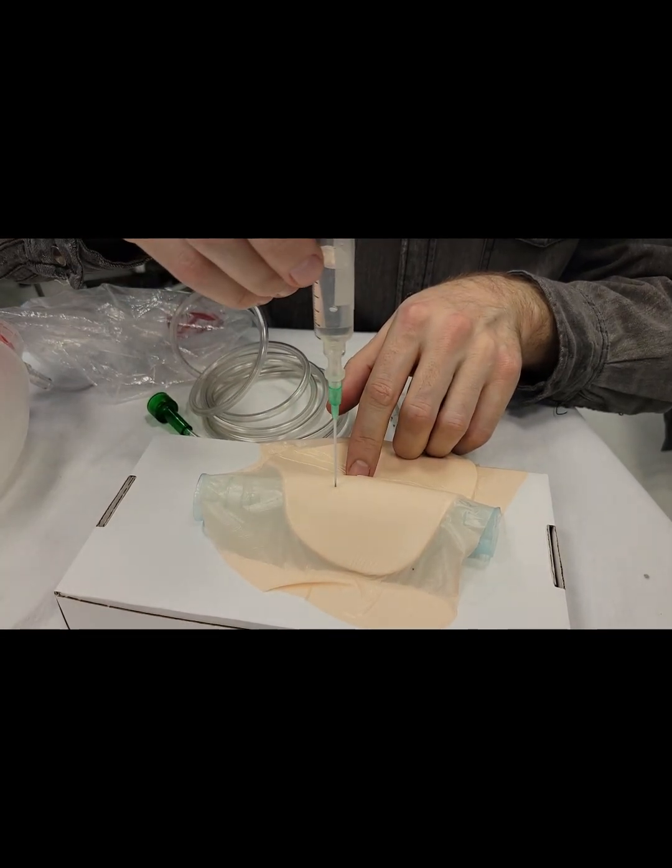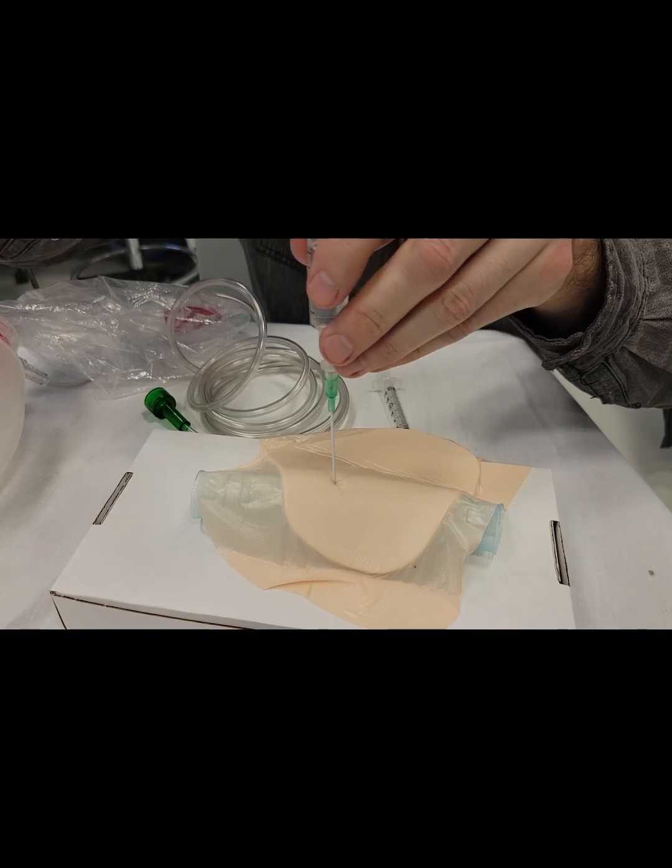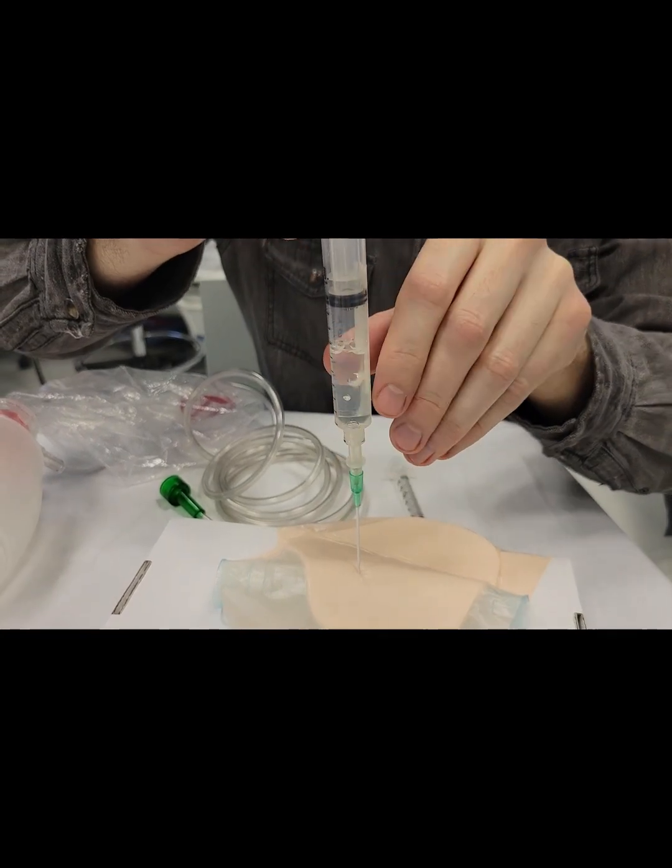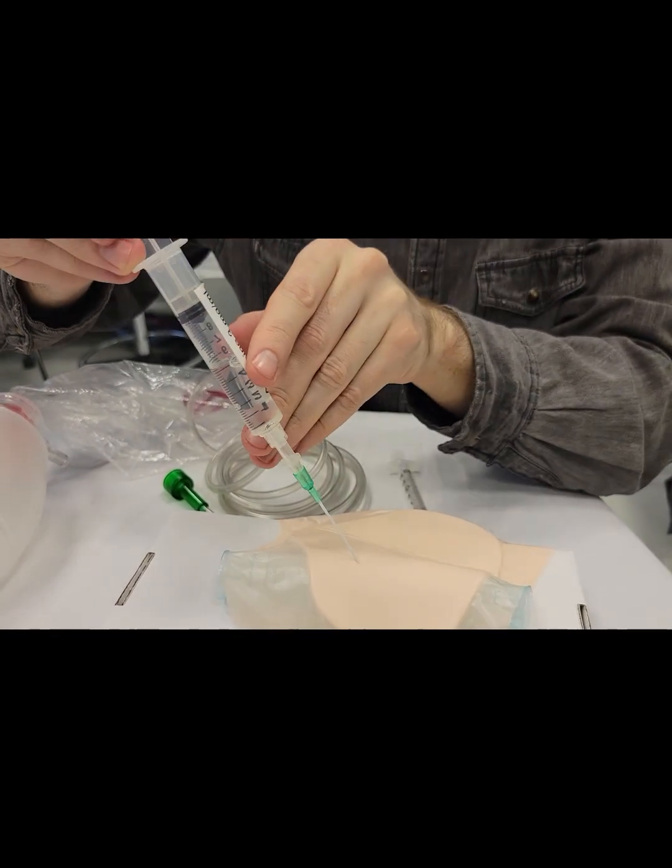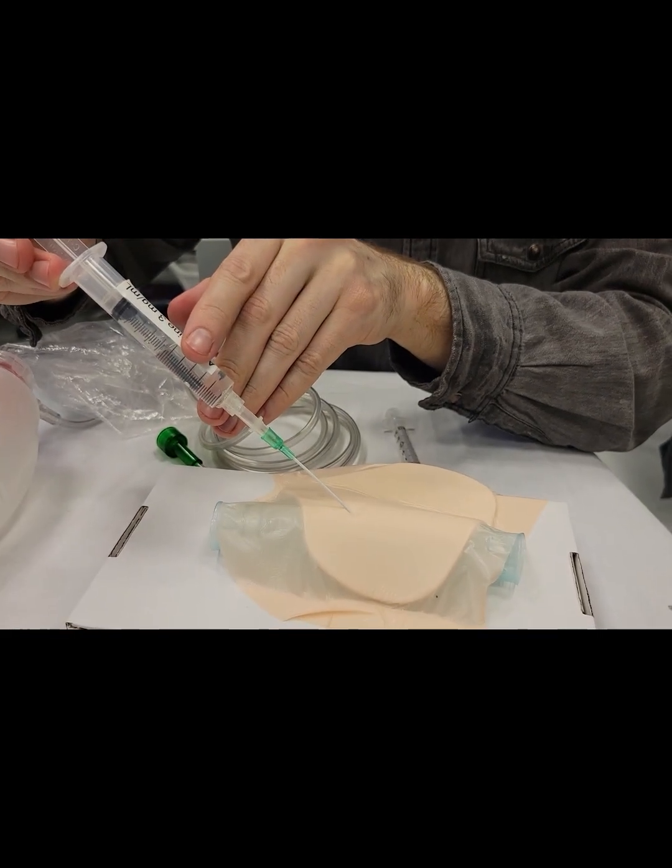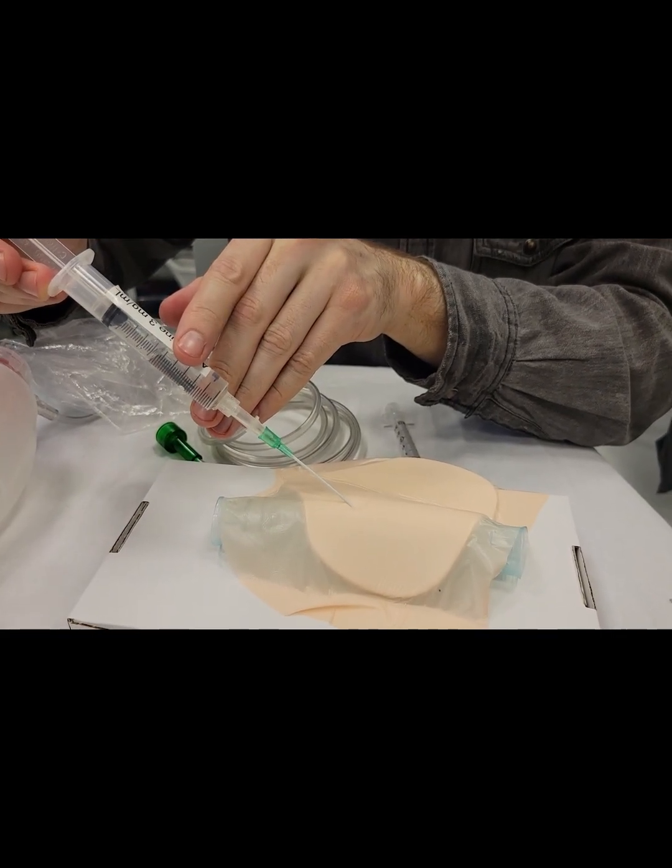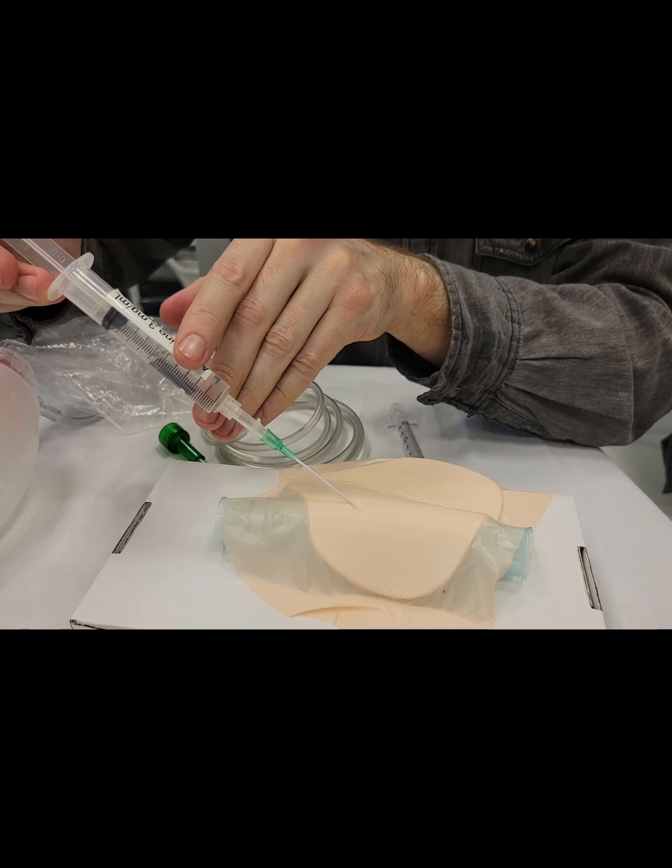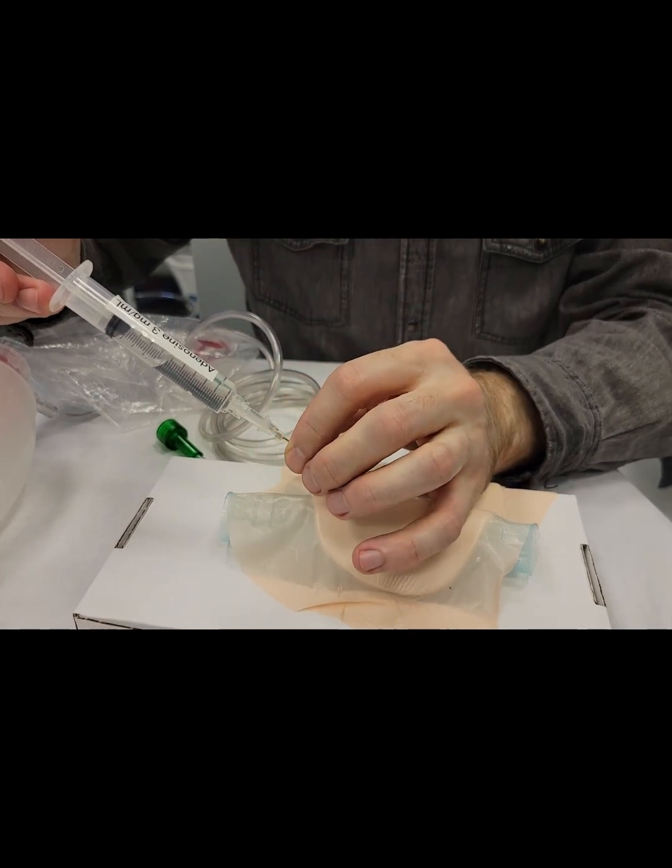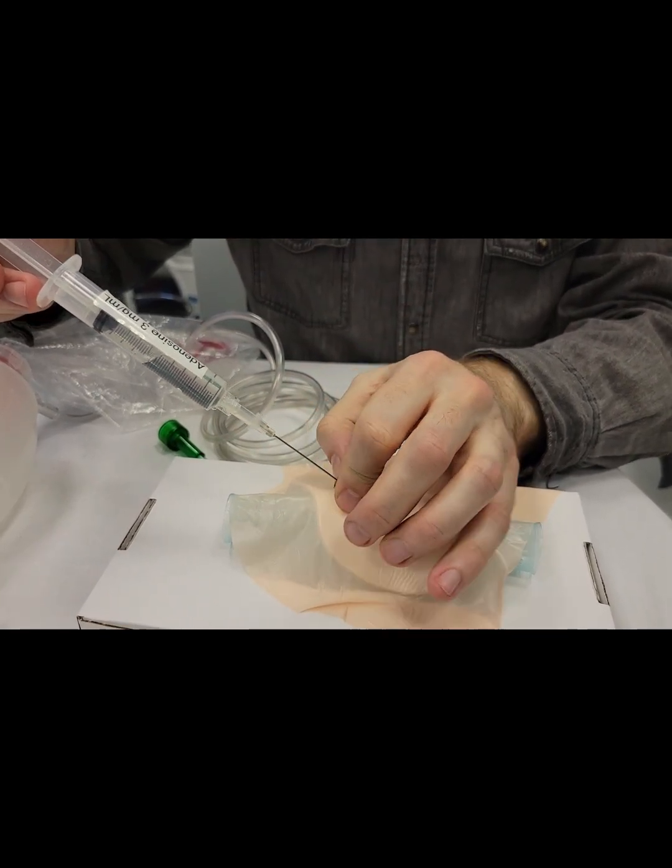Insert the needle first perpendicularly, aspirating as you're going. Once you get bubbles in the syringe, you know you're in the trachea. Tilt the needle 45 degrees towards the feet, advance the angiocath, withdraw the needle.